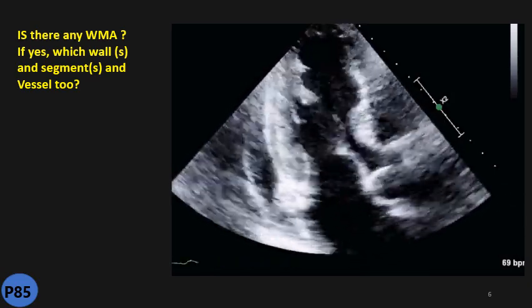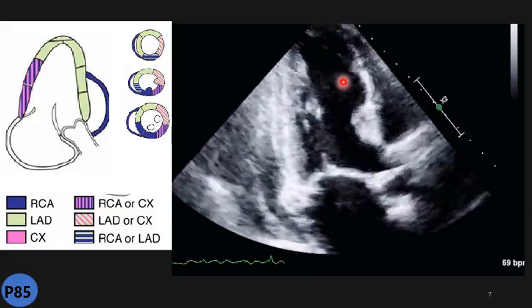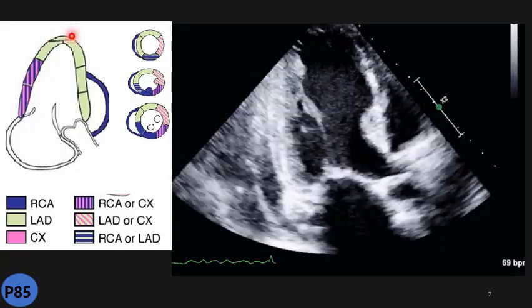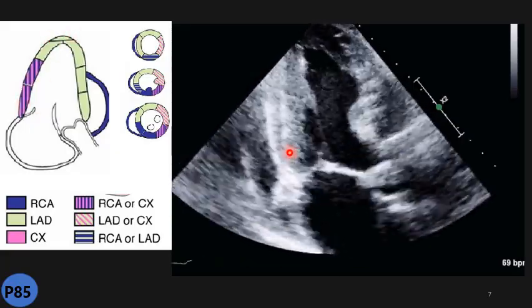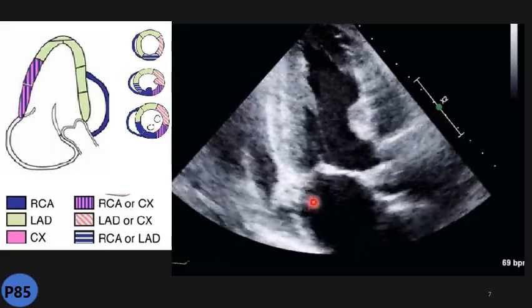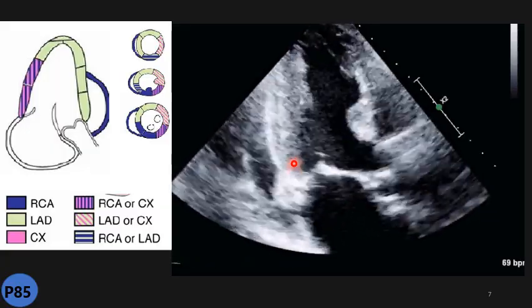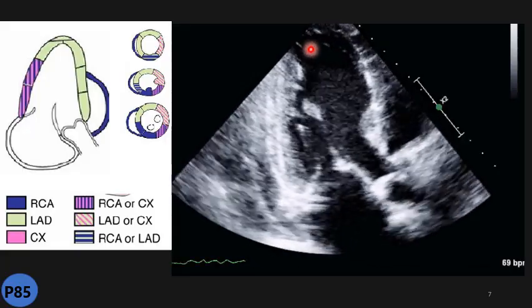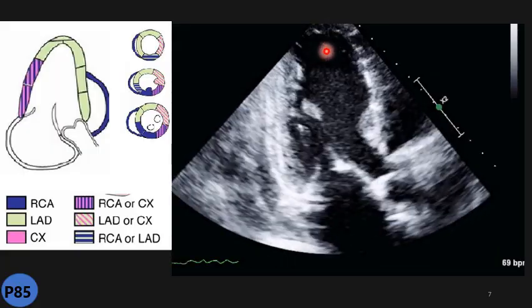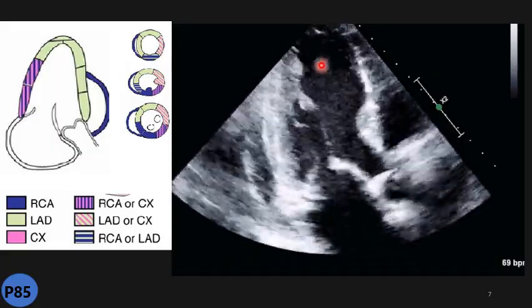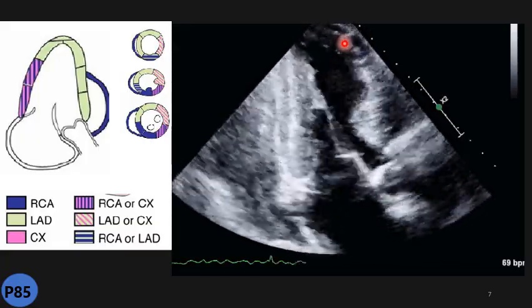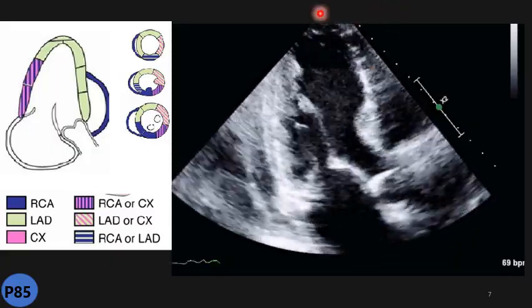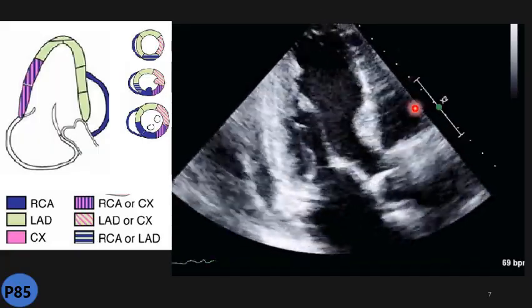Next case: here we have apical 3-chamber. We have the posterior wall — also called inferolateral wall — basal, mid, and apical, showing normal kinetic or maybe slightly hyperkinetic. The apex shows thickening and excursion moving toward the inside, and the myocardium becomes thick. Apical and peri-apical segments show the same thickening and movement toward the center.